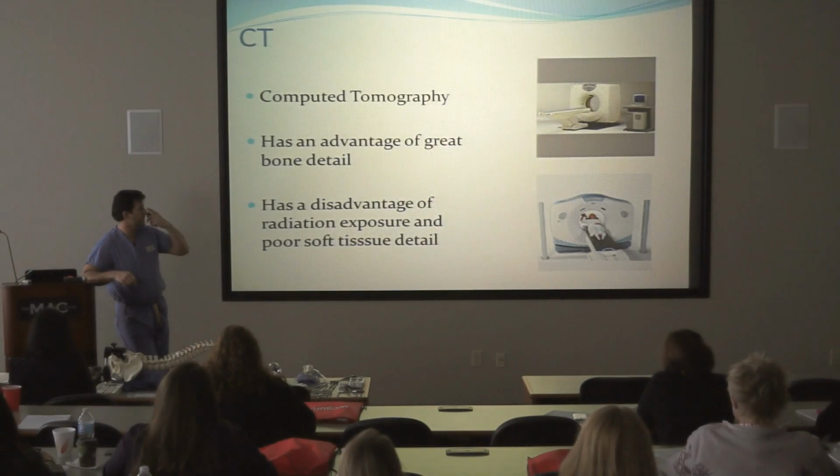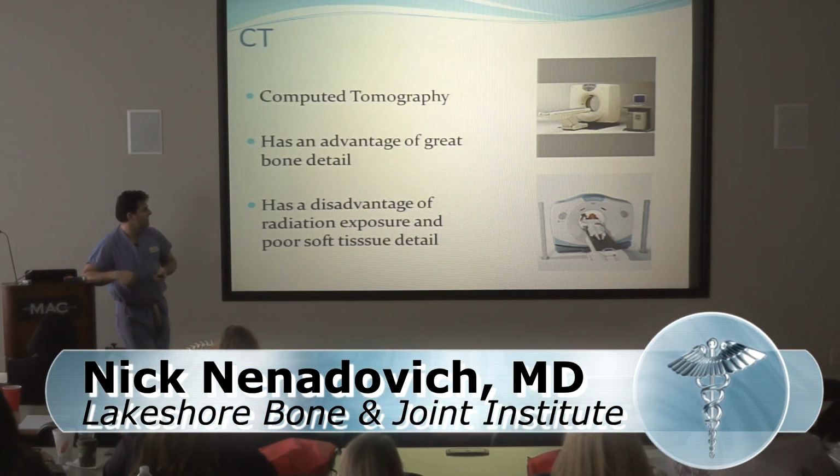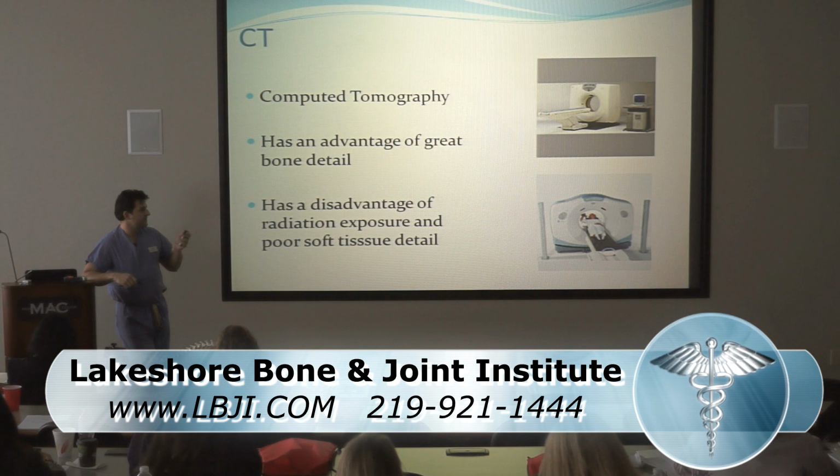CT stands for computed tomography. An advantage is that it has great bone detail. The disadvantage is that it's a lot of radiation, actually. It's like 100 x-rays at once because of the way that the CT scan works.